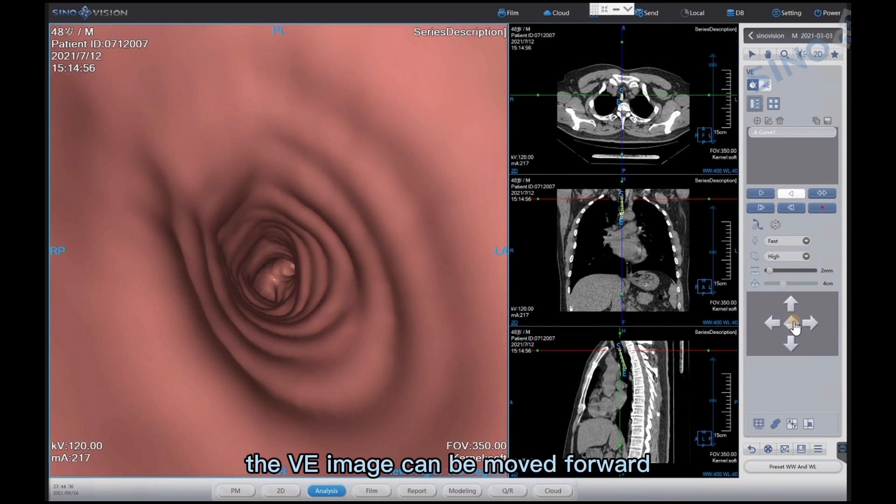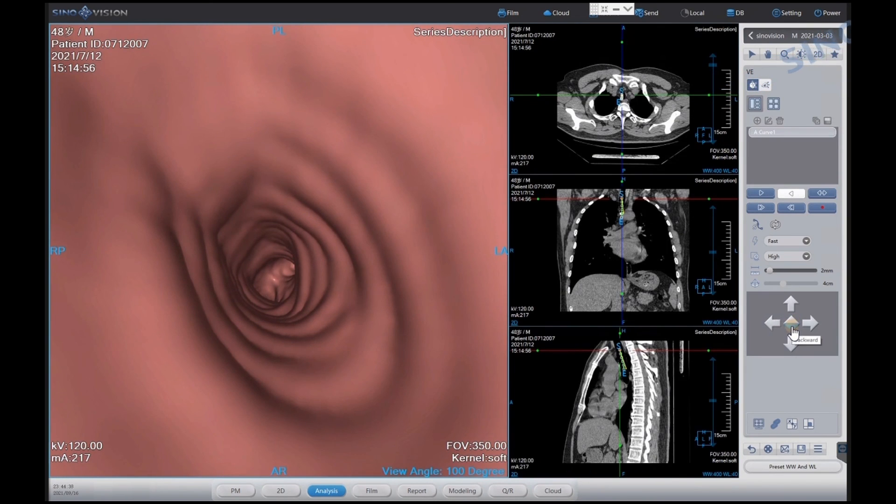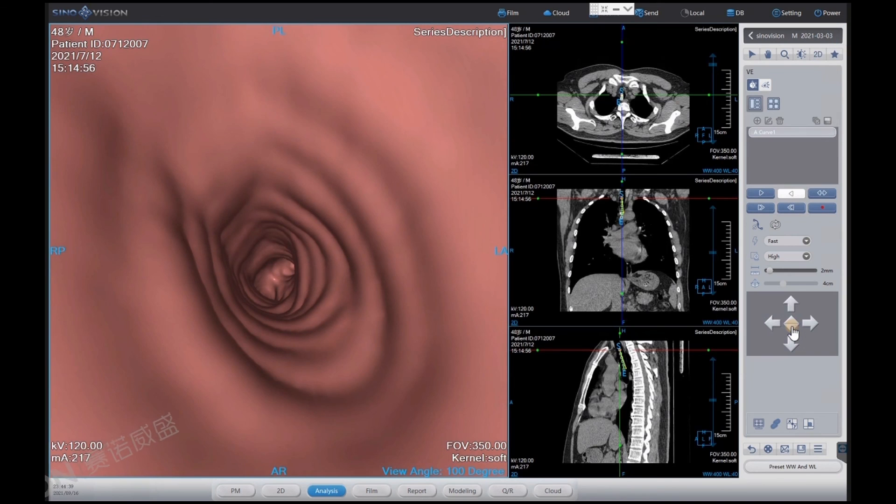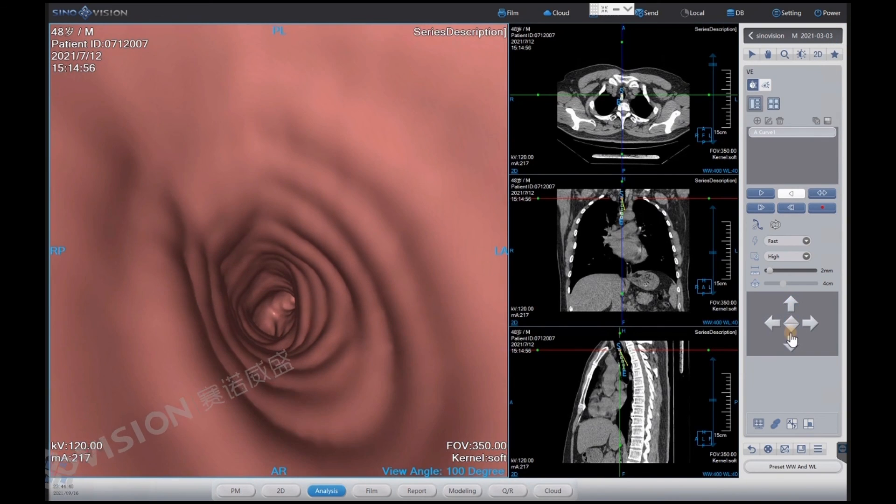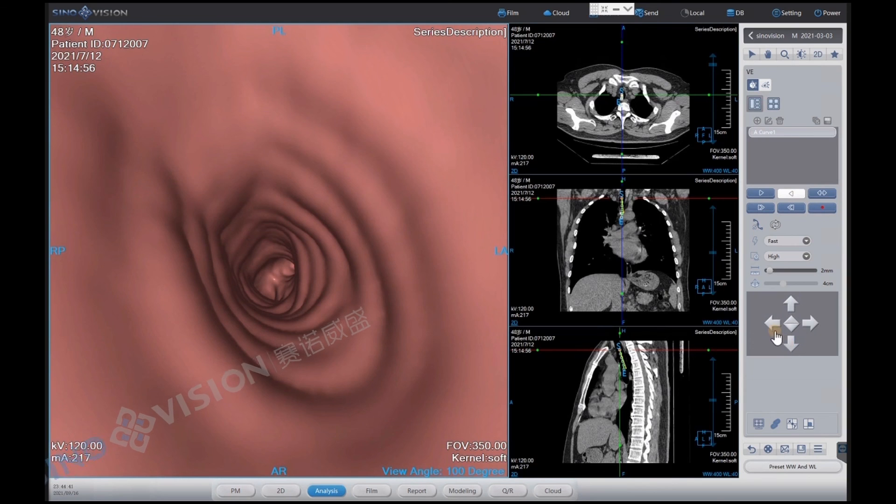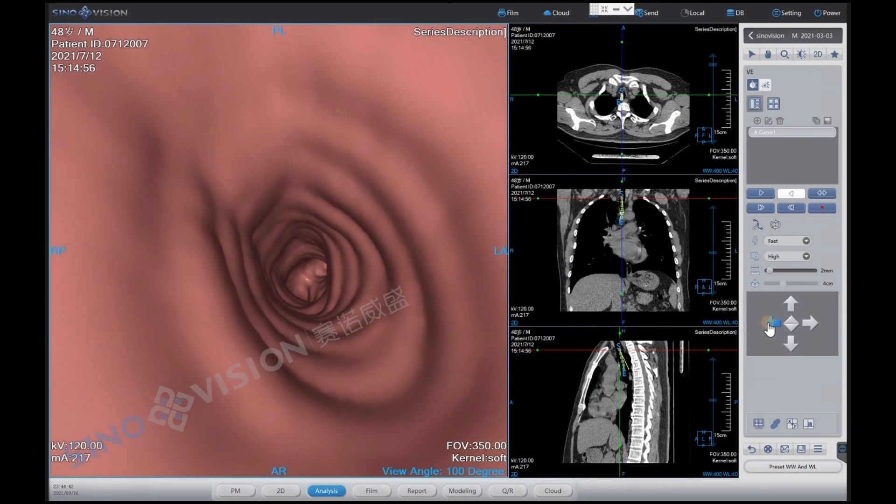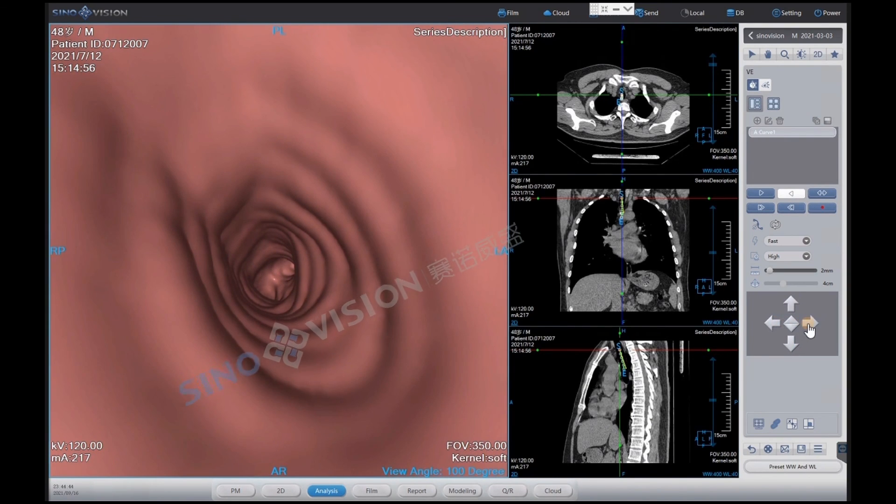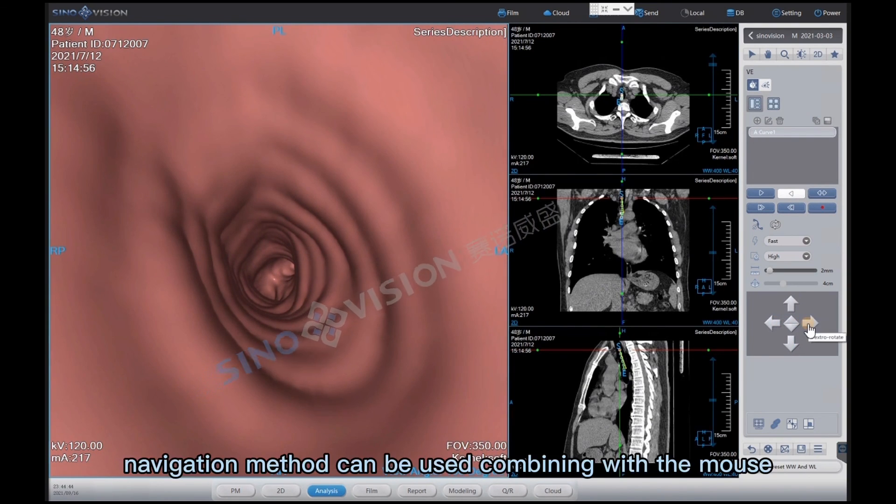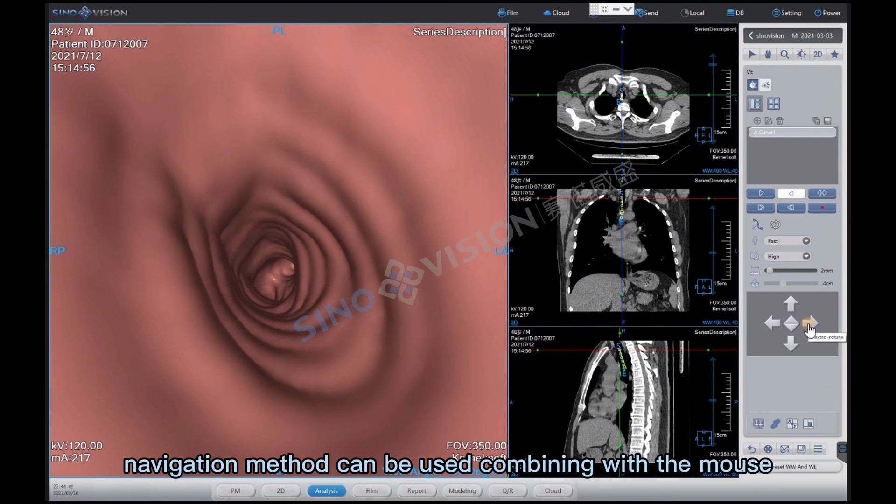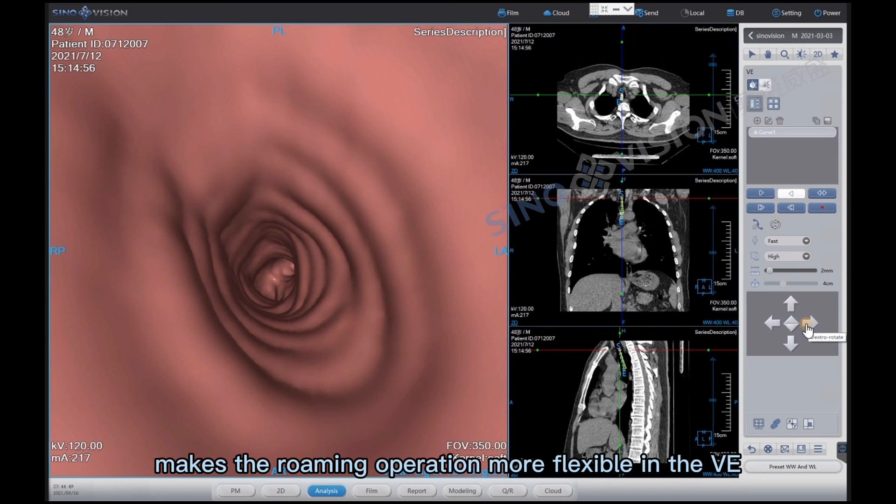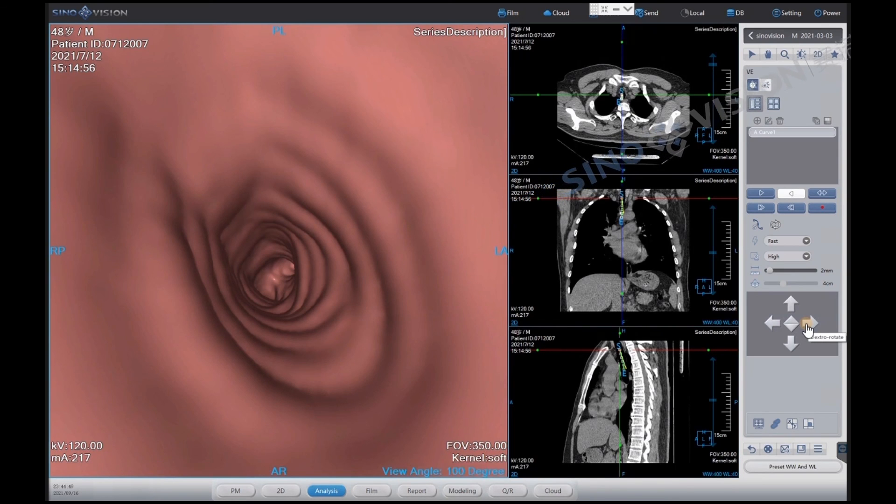Through the navigation tools, the VE image can be moved forward, backward, up, down, left, and right. This navigation method can be used combining with the mouse, which makes the roaming operation more flexible in the VE window.